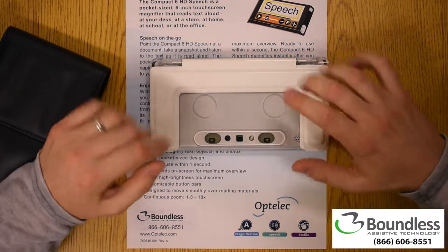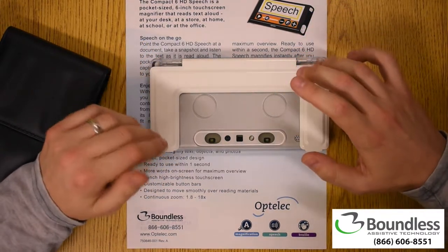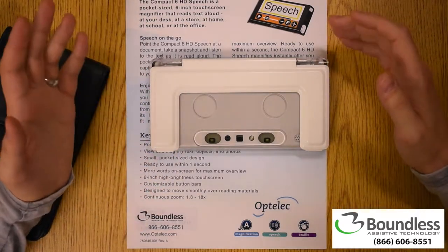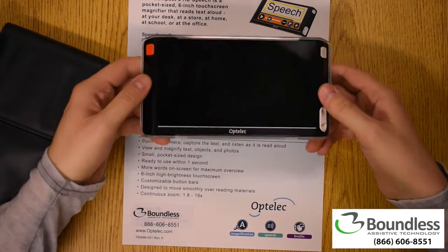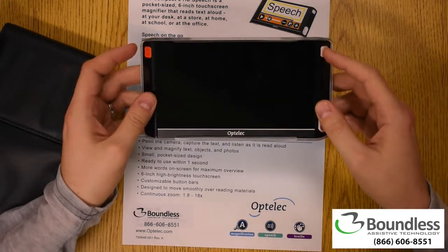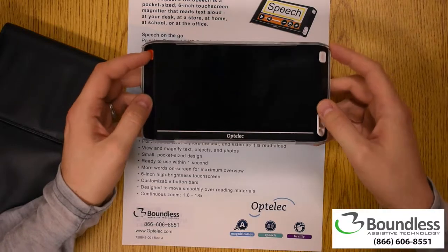That same camera is also helpful if we want to do OCR. This is the Compact 6 HD with Speech, and I mean it. There are two buttons here — power, and a button we press to take a picture and have it start reading.